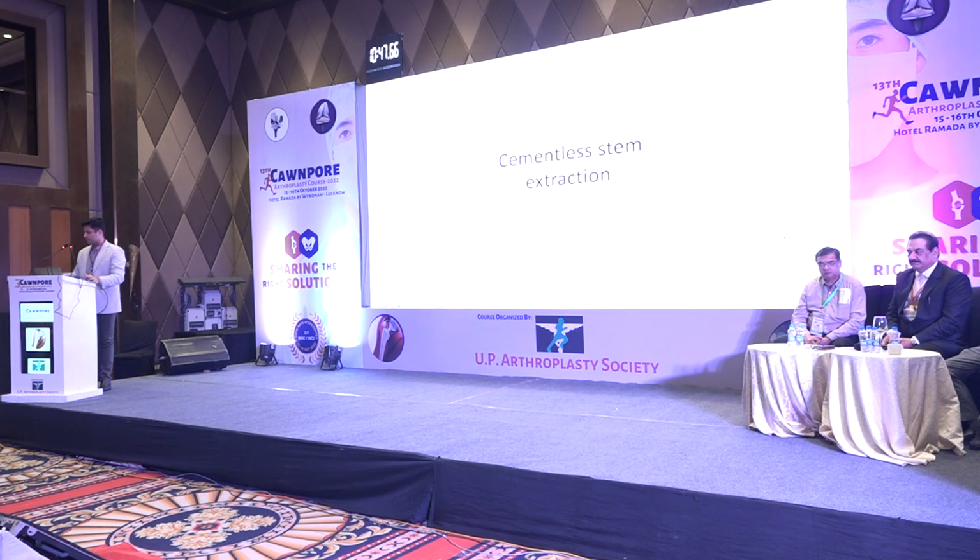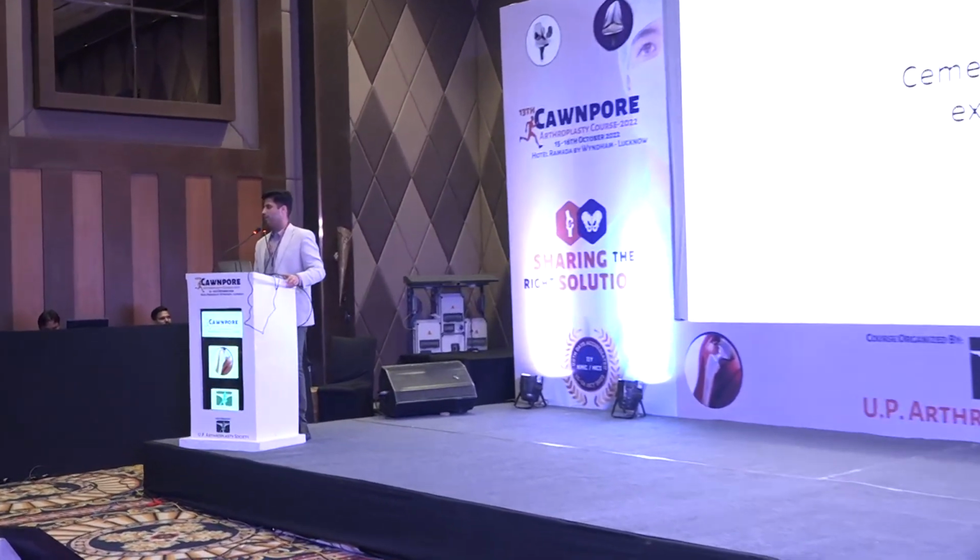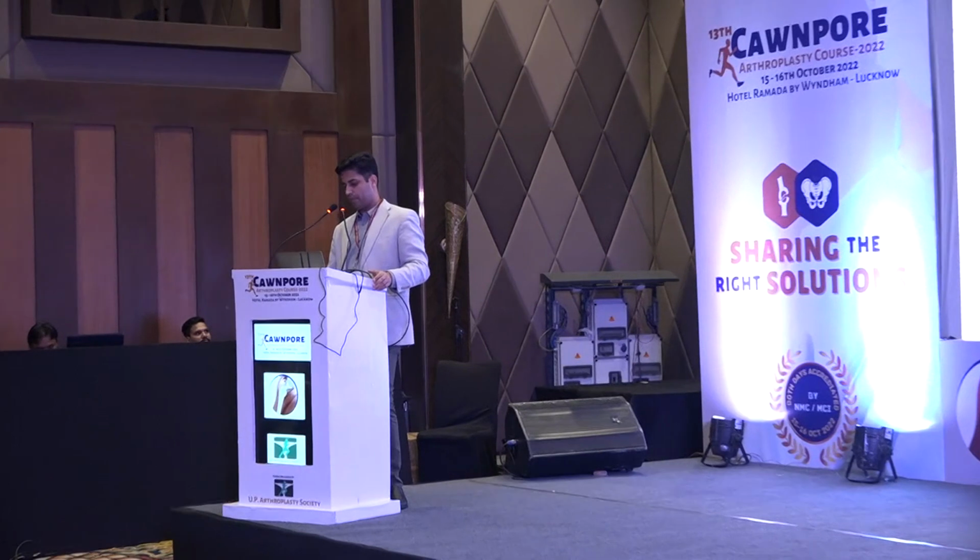Whereas cementless stem extraction is actually a pretty tough job. I mean, all of us have burnt our fingers many times trying to remove the whole of it. I think if there's a single thing to do, I'll tell you to straight away go for an extended trochanteric osteotomy and try not to remove it through the different methods described here.